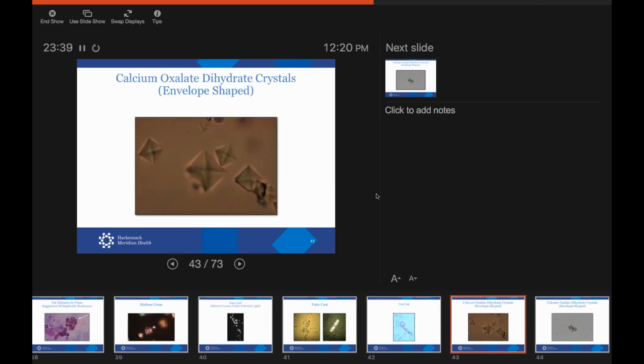Oh, go ahead. So when we order a UA, is there a specific order that we can place where we can emphasize, can you please look at? Well, you can. The answer is no. Even in very big centers, I won't name names, that's not my style, they don't do this correctly. In my estimation, I'm just guessing, there's probably maybe only 15 hospitals in the country that really look at urines and have the same diligence to urine analysis reporting that you're supposed to have. But that's how the board reports out UAs.